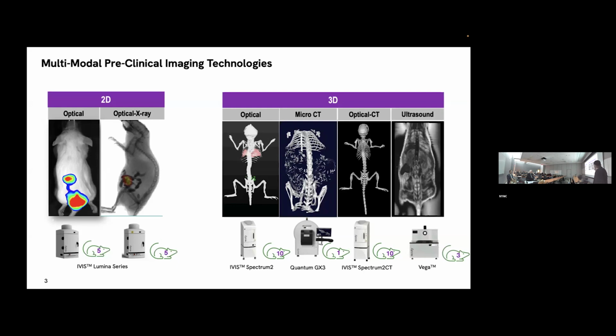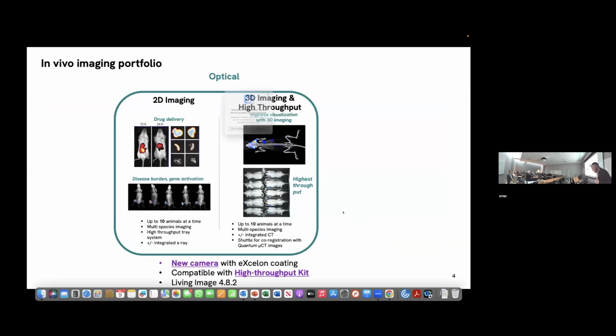But with the optical CT, you are able to basically have the two elements, the CT by itself with the remounting in 2D or 3D, but most importantly, a GPS localization of where the tumor is. Within this context, to be completely comprehensive, you can add an ultrasound element that is just here, or do ultrasound CT that we do classically in cardiovascular.